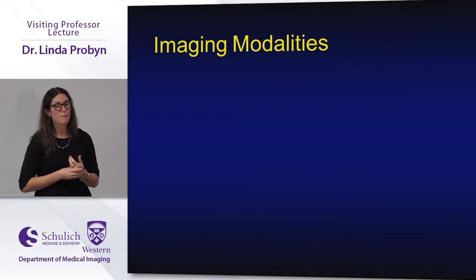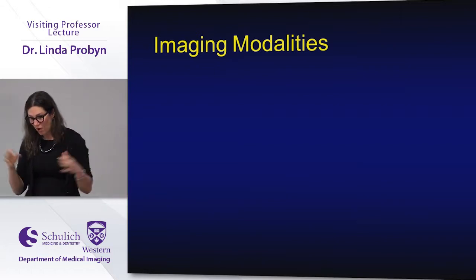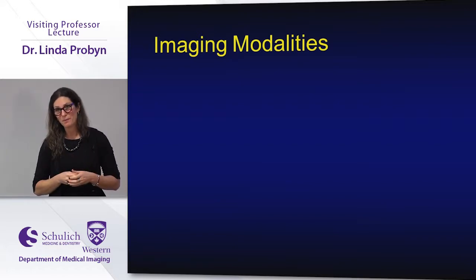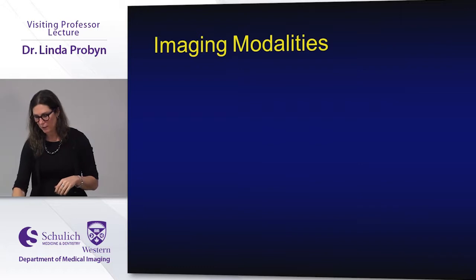Okay, so we're going to move on and talk about the different imaging modalities, because these can be seen on many different imaging modalities, pretty much all of them. I'm going to show you examples, and it's important to be aware of them because you may not be looking for these, and that's what happened in a couple of cases here.